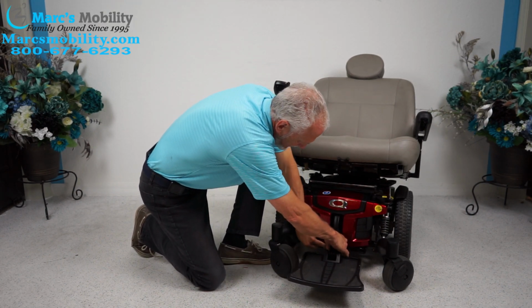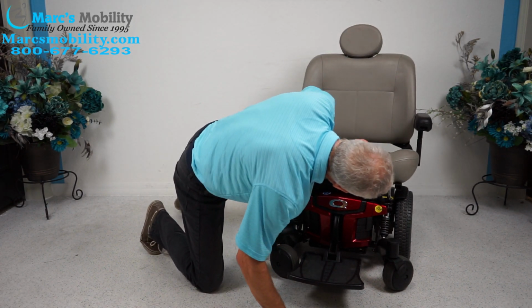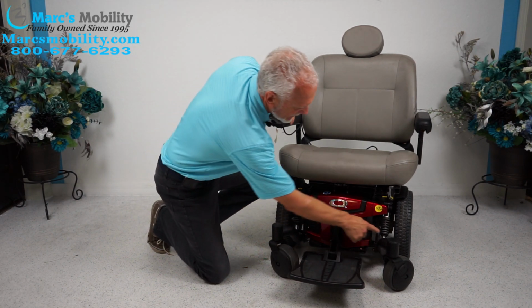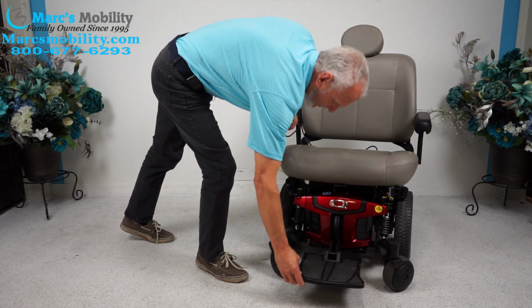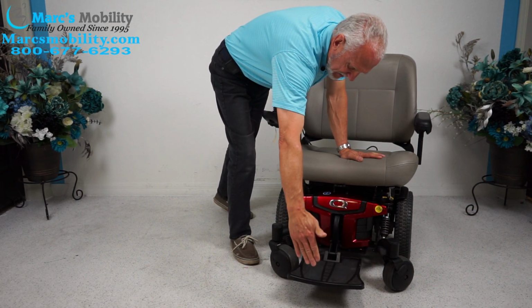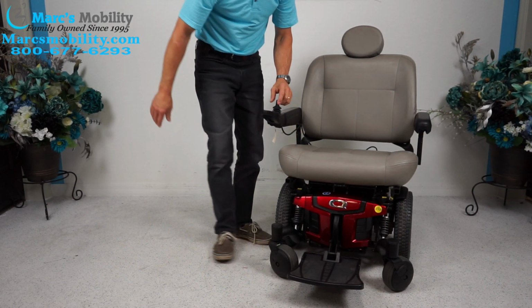So we'll put the seat back down. There we go. Okay, so you can see the suspension I was talking about in the front also. So the foot plate does flip up, and it is adjustable up and down on this bar, and also it is adjustable this way. Right now it's sitting as far out as it can go, but we can bring it back in where it sits right about here. So it's adjustable up and down, in and out.